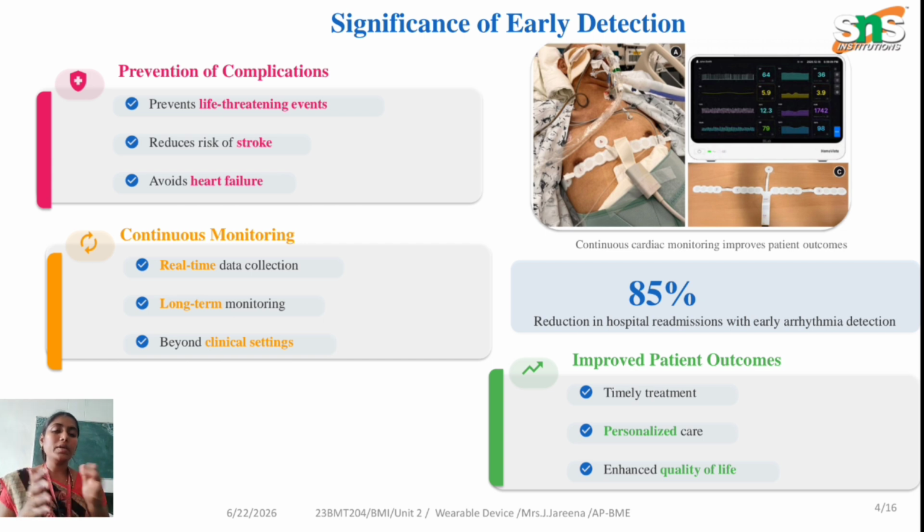Apart from that, patients don't need to go to clinical settings on a daily basis. If you are using wearable cardiac monitors, it has given results of nearly 85 percent reduction in hospital readmission because of early detection of arrhythmia. So that is the improved outcome you can see by using such devices like wearable cardiac monitors.